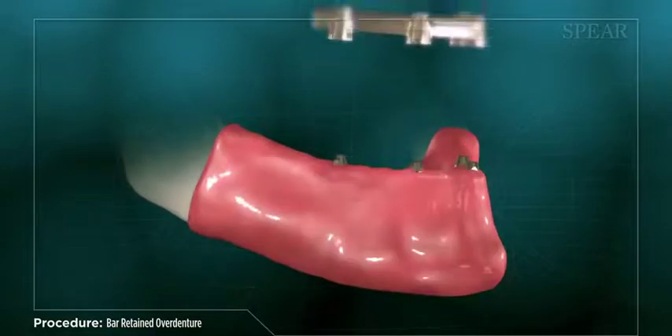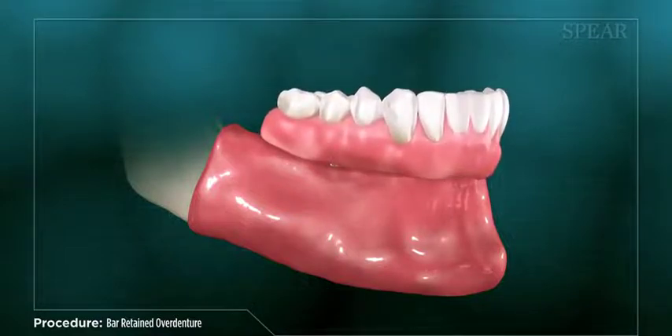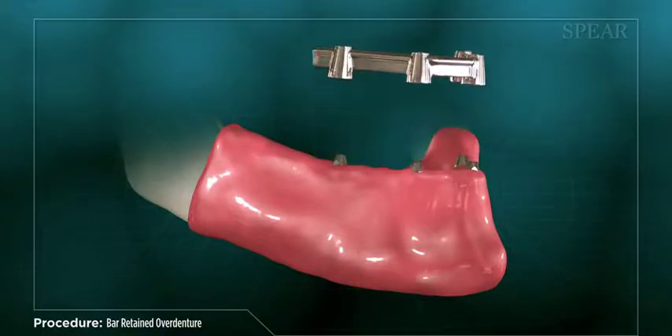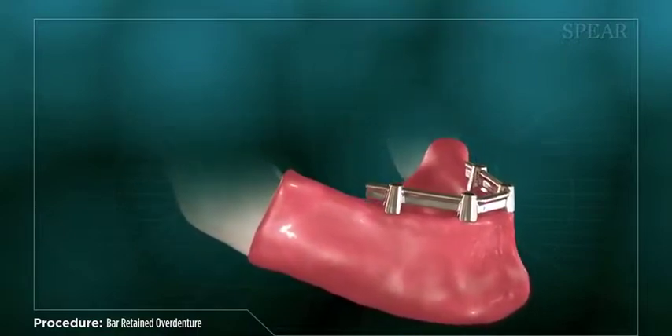During follow-up appointments, your doctor will check for proper fit and bite alignment of the bar and final denture. It may require multiple incremental try-in fittings to ensure the best final result for you. Once all adjustments have been made, the support bar is fixed in place and the overdenture placed onto the bar.